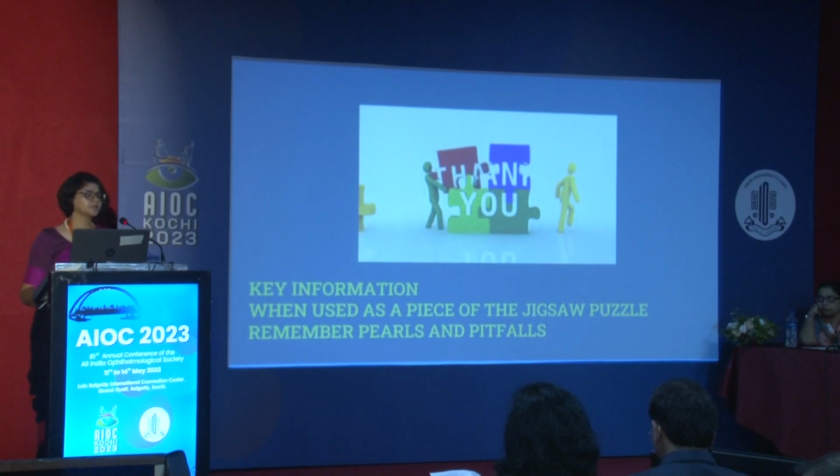We've been generally doing the RNFL GCC scan, OptoView, along with the visual fields, and we are seeing that there is an association of the GCC findings with subsequent field conversions.